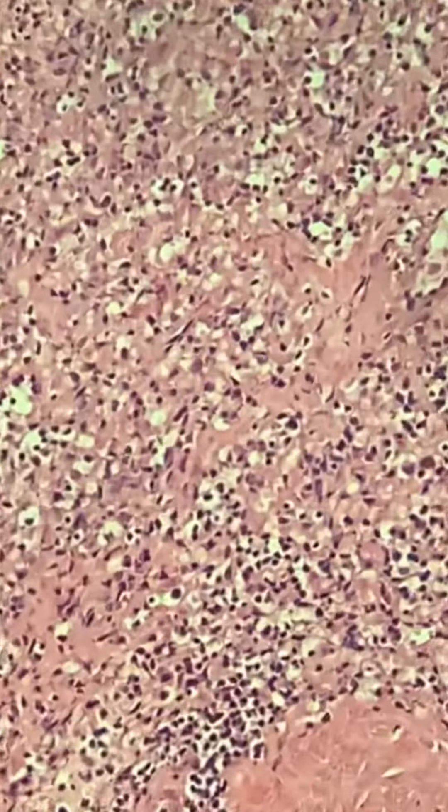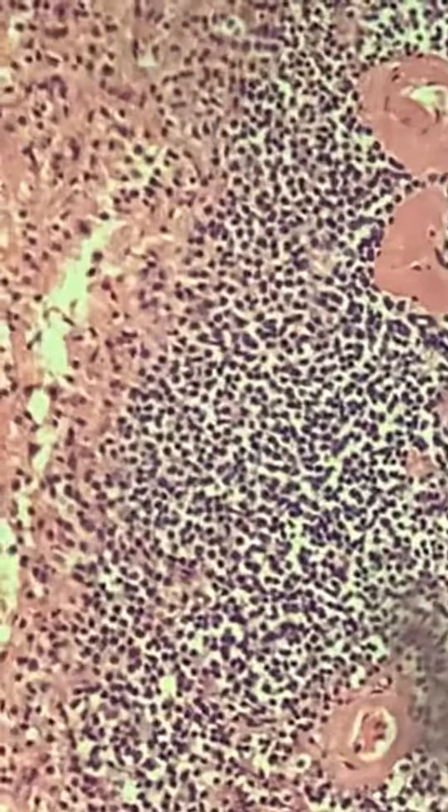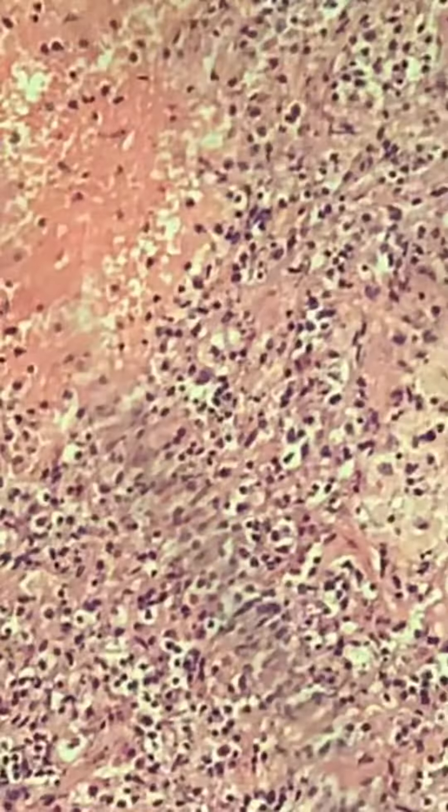Now we're viewing the spleen. You see the red pulp and the white pulp — we call it the white pulp where the lymphoid tissue is, and the red pulp where you see mostly blood vessels and red cells. Going to a closer view, the white pulp is here and everything surrounding it is the red pulp. It's edematous because this person has sepsis. You can see some blood cells there — that's the red pulp.